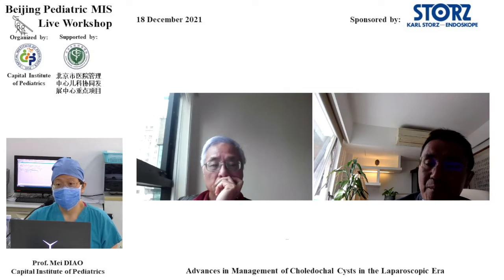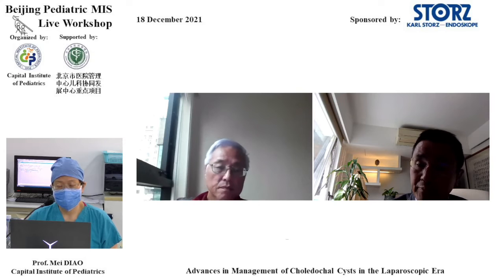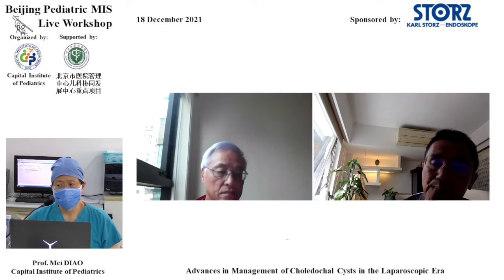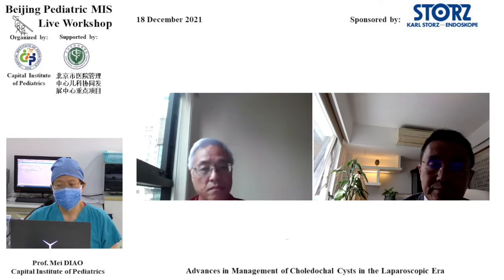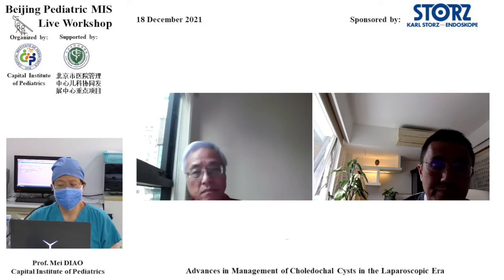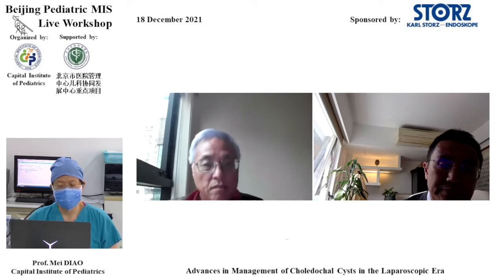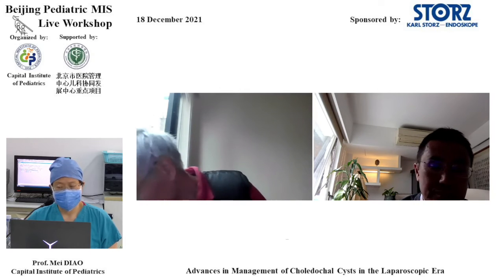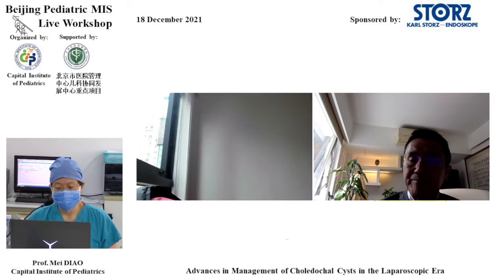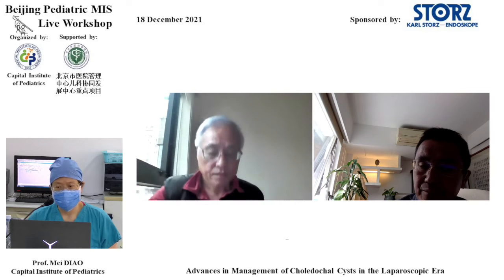We started conventional laparoscopy HJ since 2001, and after 2011 we used the single incision laparoscopic technique, and we also expanded this technique from a simple choledochal cyst to each type of complicated choledochal cyst, like perforated CDC, redo and staged surgery, neonates, and giant CDC. And after the learning curve, I think the results are similar between the single incision and the conventional one.